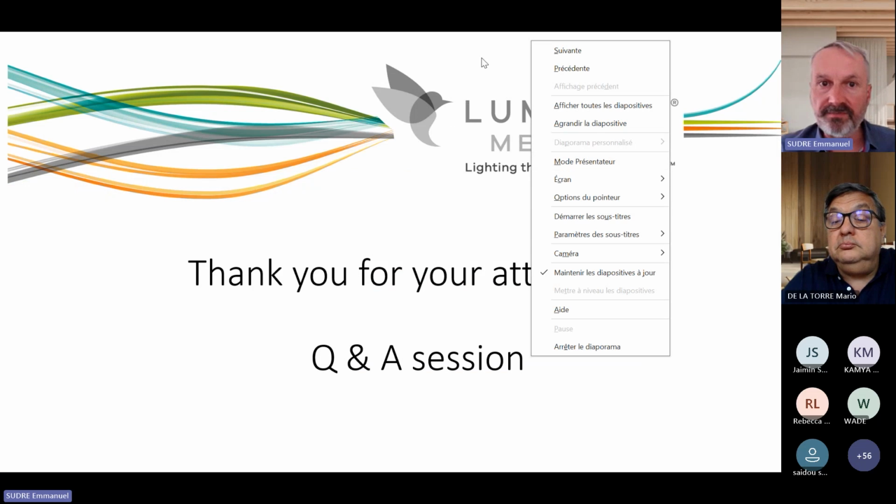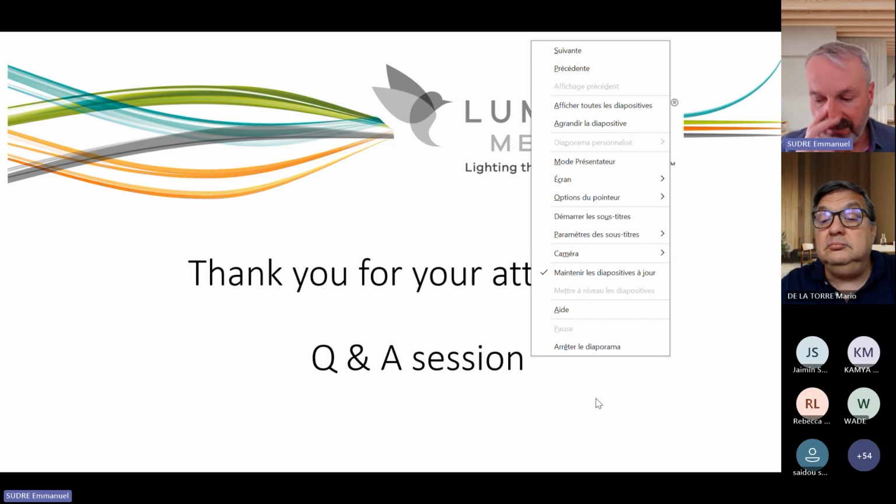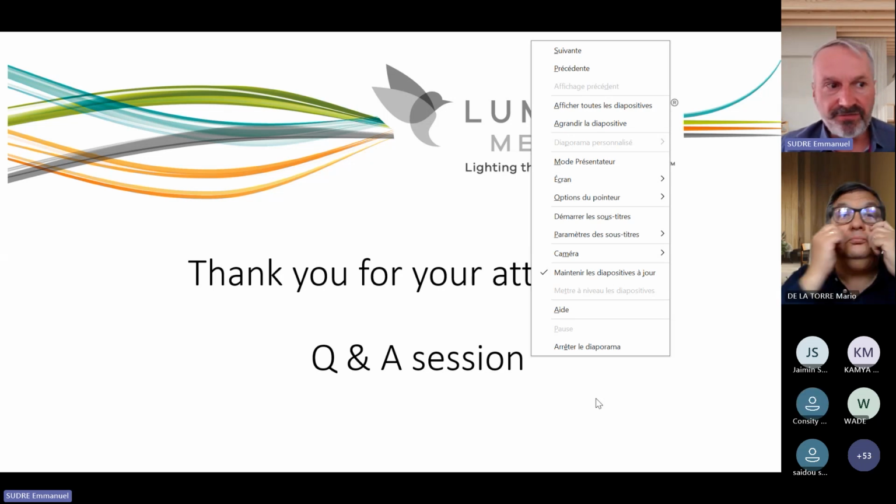If I go to the questions, one doctor asked about the use of MLT. MLT is another technique. This is not exactly SLT. MLT means micropulse laser therapy, which is a variant option from another company that uses a different application time of the laser beam.